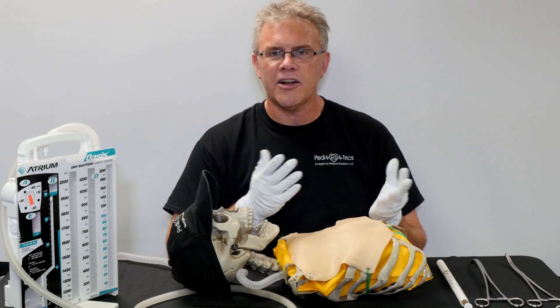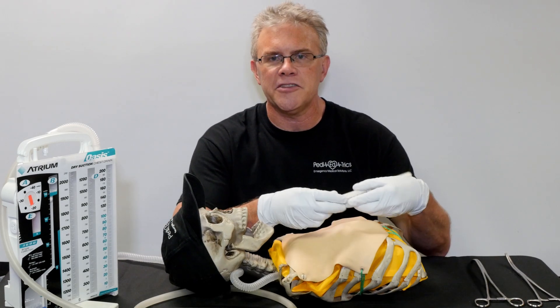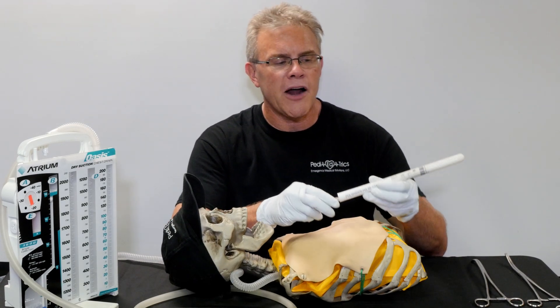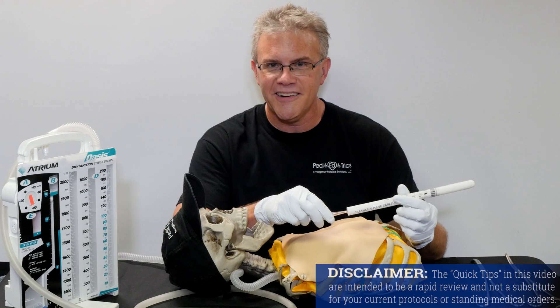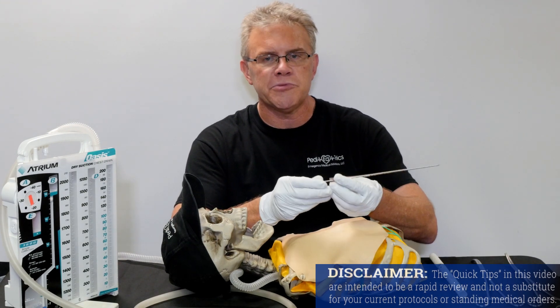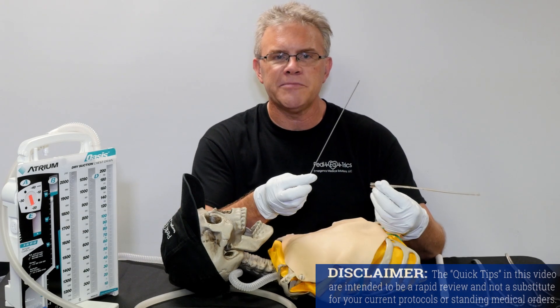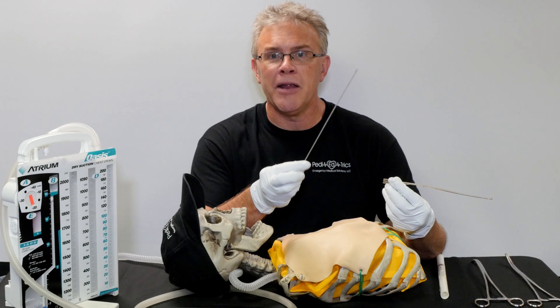However, with that in mind, a couple things to touch on. The first of which is some of y'all have been at this long enough to remember how we used to put chest tubes in — back in the day. Remember, we had chest tubes with something called trocars, and trocars were otherwise best described as spears.